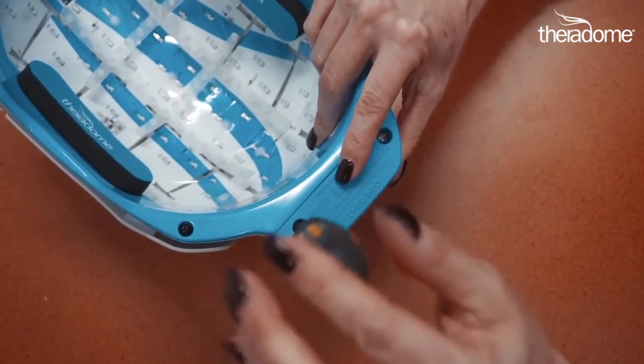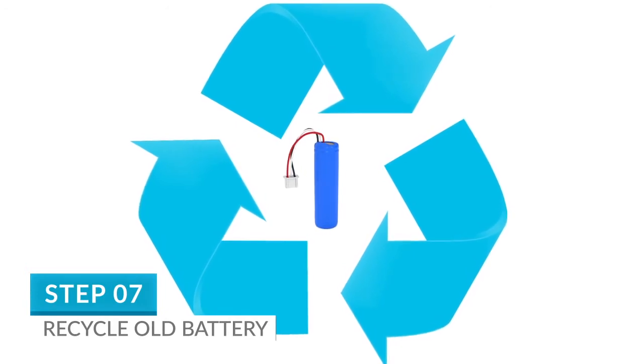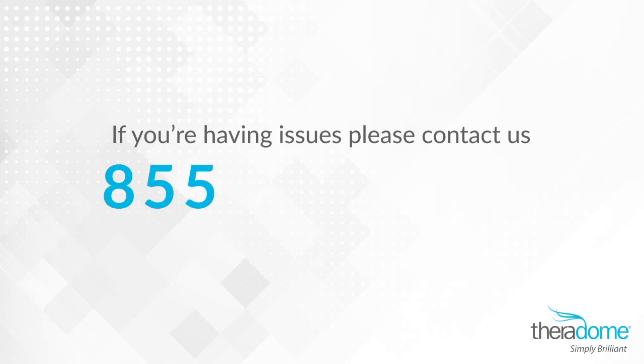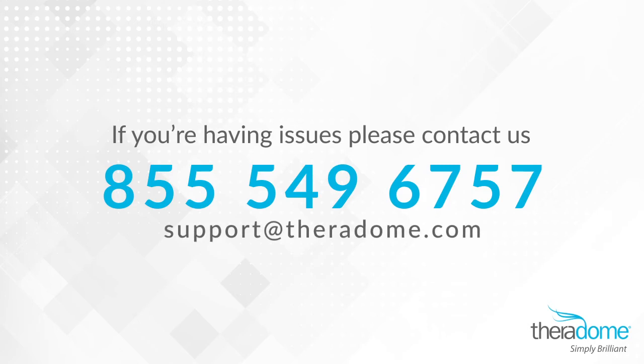The battery replacement is now complete. Step 7. Don't forget to recycle the old battery. If you're having issues, please contact us at 855-549-6757 or email us at support@theradome.com.